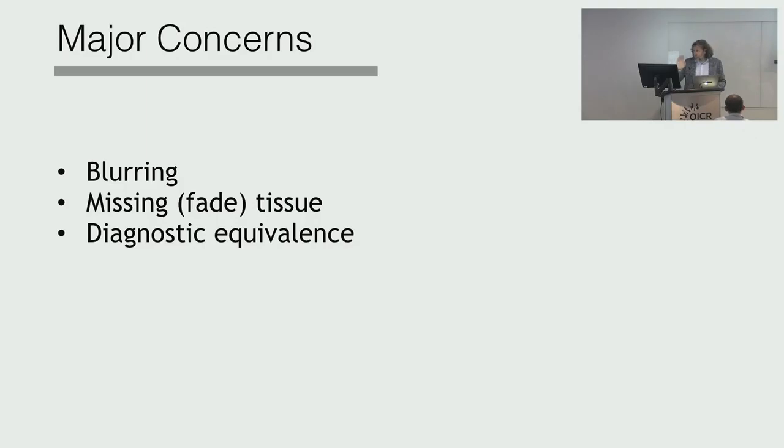Not money-wise. Again, administrators of the hospital will lecture us that, look, this will cost money. We don't have that kind of money to completely change the IT infrastructure. An average lab may do 700 patients a day, each one of them 2-3 glass slides, times 365 days. So that's terabytes and terabytes of data. So you need infrastructure to do that. We are not concerned with that. So from a diagnostic perspective, what are the concerns?